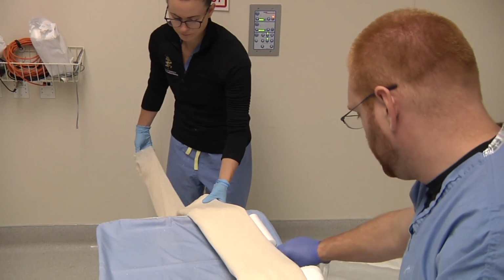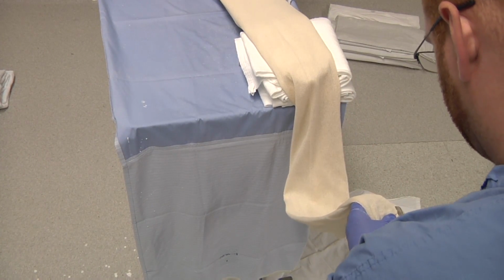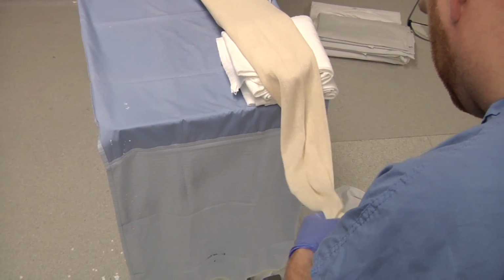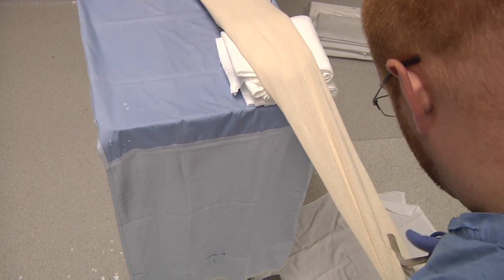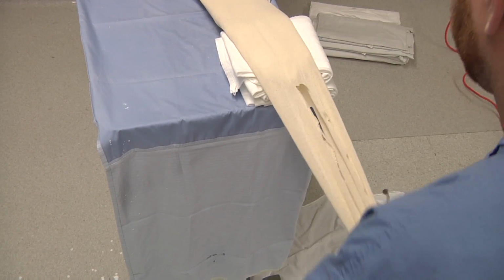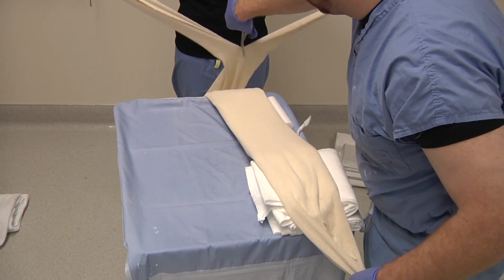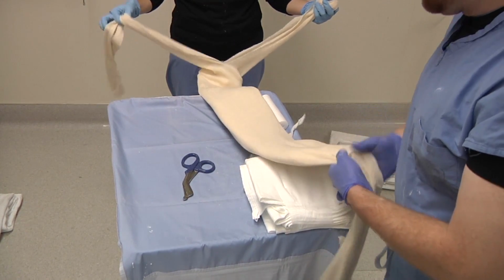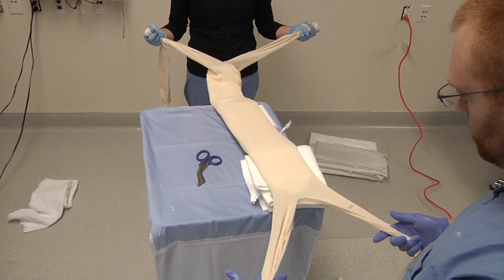Take it at either end. You split and tear the tubular bias to a couple inches from the end. Helps when somebody applies a little bit of traction force. Next, we have our burrito in the middle, two sections with two limbs that we'll be using to tie around the patient.